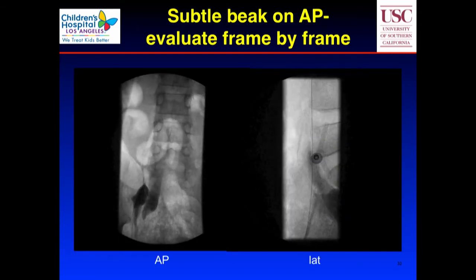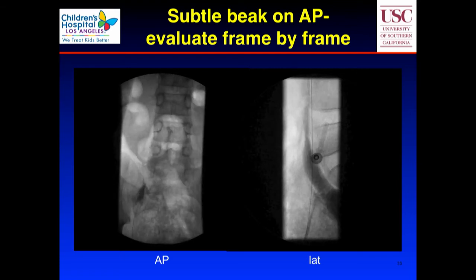So again, sometimes the beak is very subtle, and you can see that there's a tiny little beak, and you have to go frame by frame to figure out where that beak is. You've got to be very careful in looking at it.